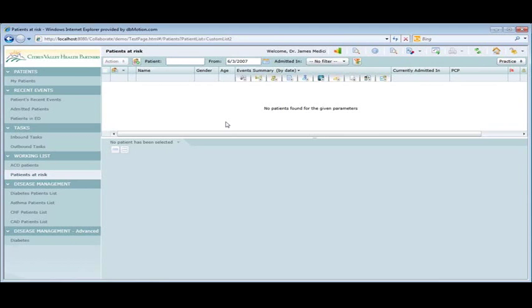One of the things where I think we're still very, very ahead of the curve are two things. One is the vocabulary semantic piece. We continue to be very, very far ahead. Other people are just starting to claim they do semantic interoperability, but they're still doing a lot of manually mapping. I know that our lead has been narrowing very, very quickly along that edge. But the second piece of this is having that EHR agent. So bringing this information to the point of care and having that semantics on top of that is huge. And now having this population health piece.